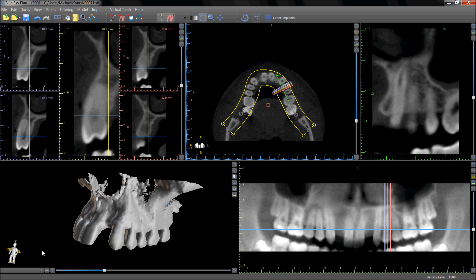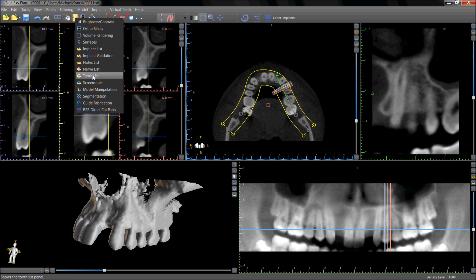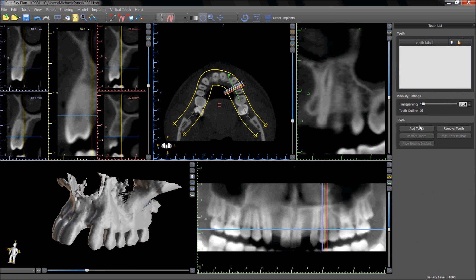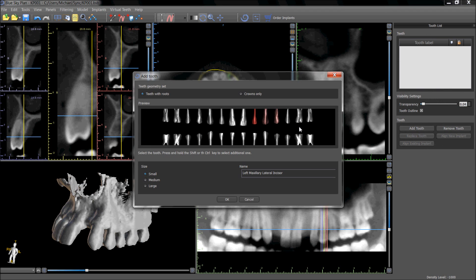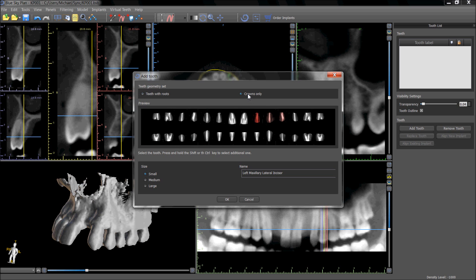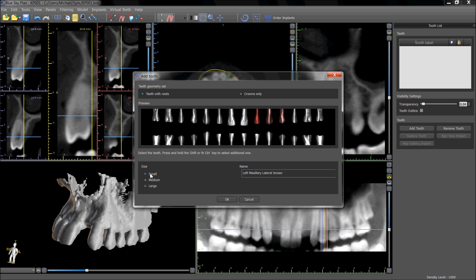Virtual teeth can be added to a treatment plan by clicking on the icon of the tooth with the red plus, or via the tooth panel. The user can select if they would like to insert teeth with roots or crowns only. The general size can be selected from the radio buttons in the bottom left. The desired tooth can be selected by clicking on the relevant tooth.